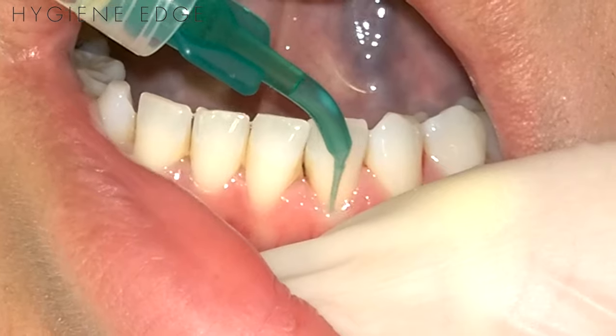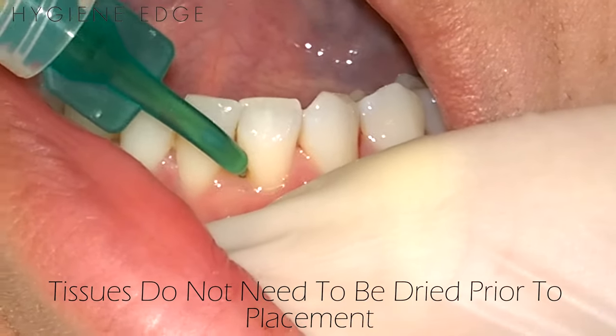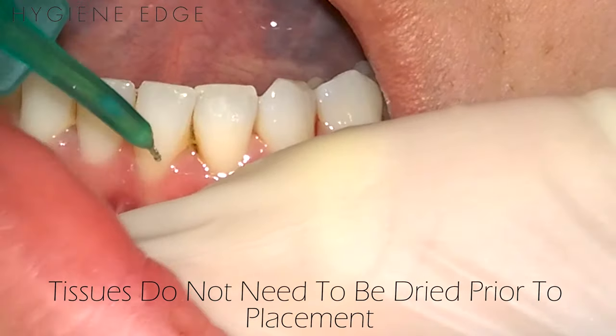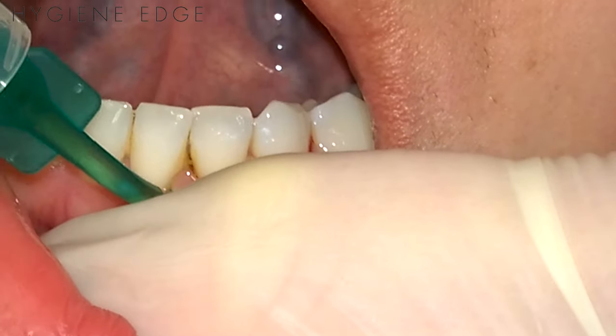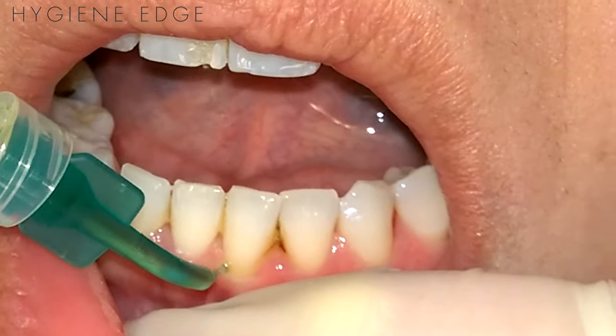To apply the Cetacane, place the tip subgingivally and slowly press the plunger while following along the base of the pocket. It has an onset of about 30 seconds and will last anywhere from 30 to 60 minutes. It's a great option for those localized areas of pain during scaling.